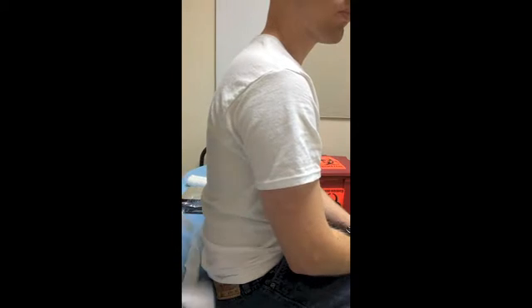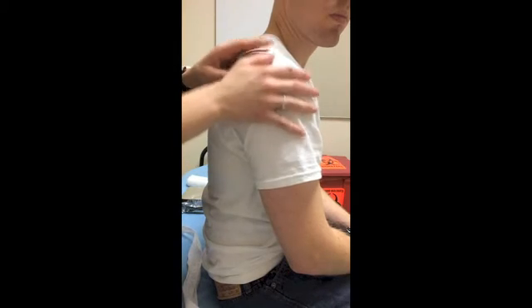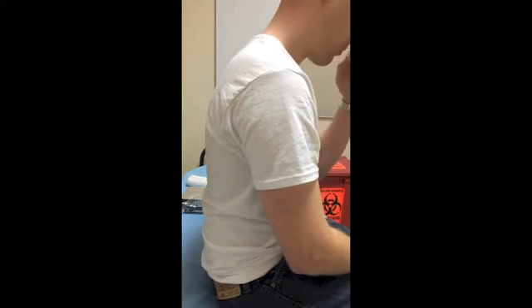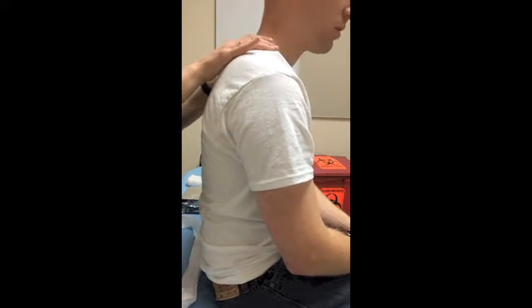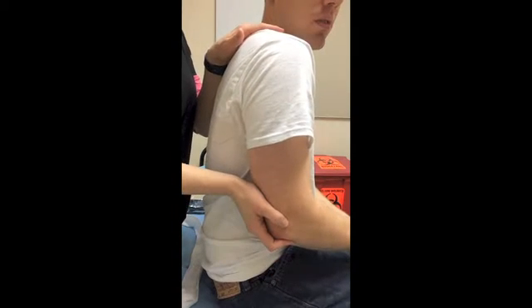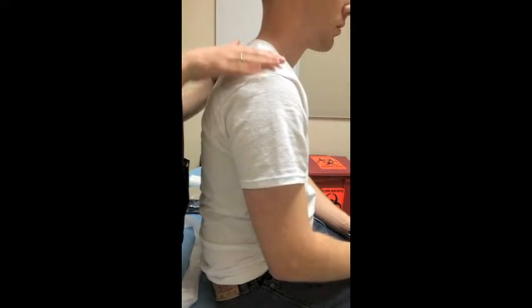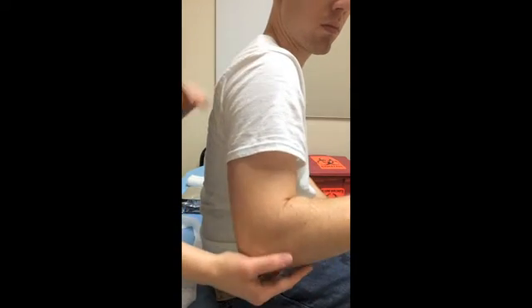For a humeral coaptation, there really isn't a way to put stockinette on the arm and allow it to protect all the skin. So we're just going to do an intricate layer of padding in a few different areas in order to protect the skin the best we can. A special consideration is that the patient's shoulder needs to be nice and relaxed. We have a natural tendency to self-splint, bringing our shoulder up to our ear. But for this splint to be effective, we need to make sure that both shoulders are even and the patient is in a relaxed position with the elbow at a 90-degree angle.